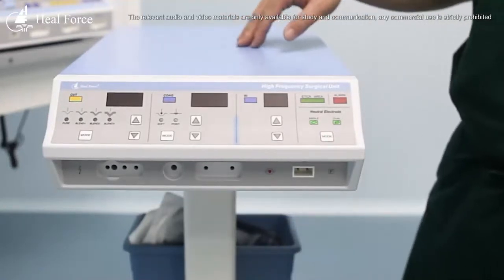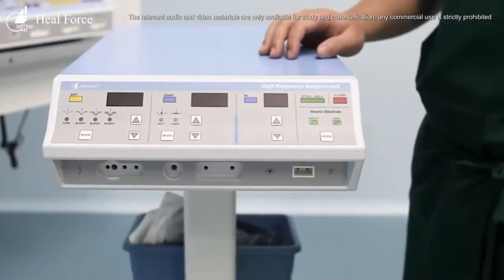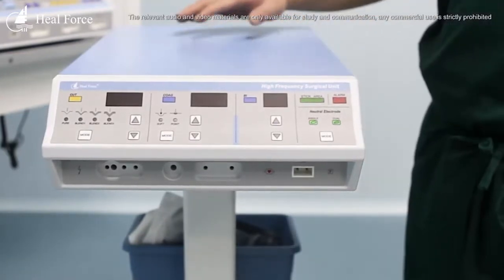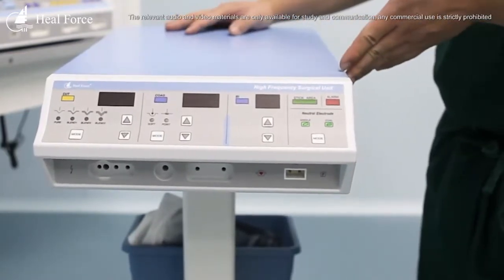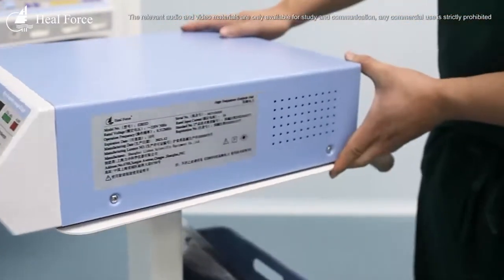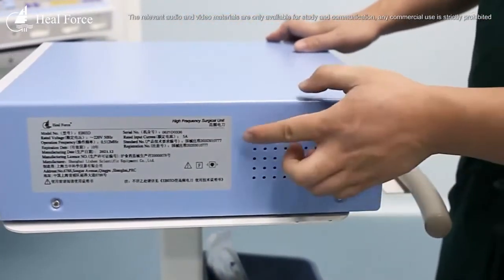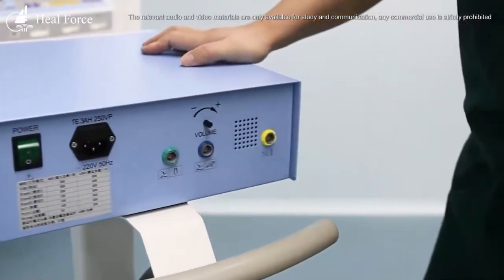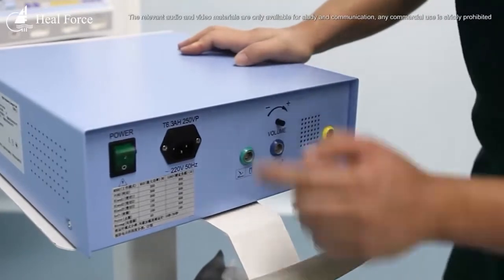Here we have our equipment EB03, together with the trolley designed for this equipment. We also have a basket to place all the accessories of this equipment.